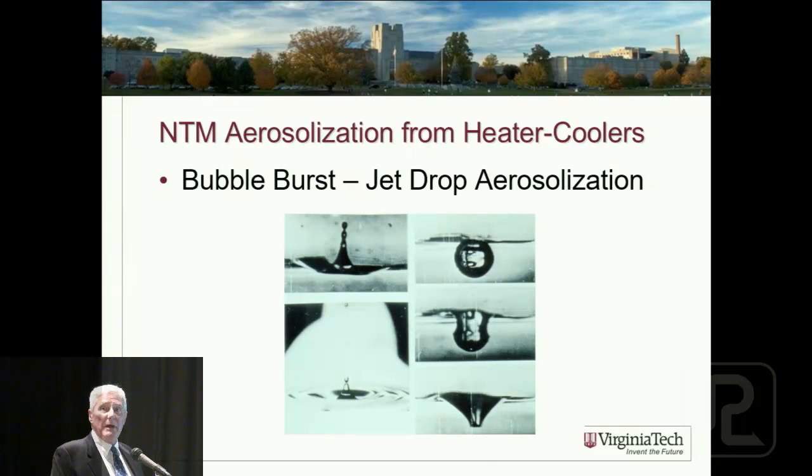Now, if you remember physics, and I learn everything through microbiology. I've learned chemistry. I've learned everything through microbiology. Here's physics. There's a force vector here that wants to close. There's one from the other side, and there's one from here. These two force vectors are balanced. This one is not. So there's a droplet. That's the little droplet that gets entrained and can be as high as 10 centimeters above. Next one, please.